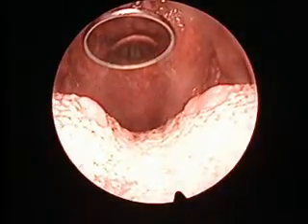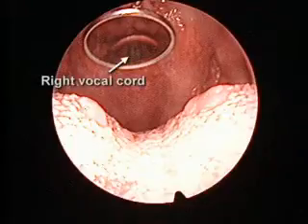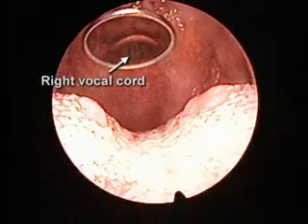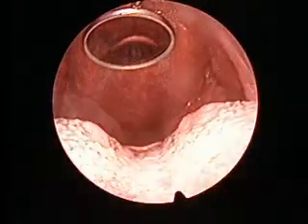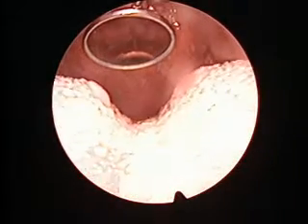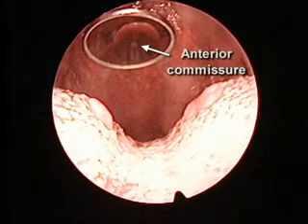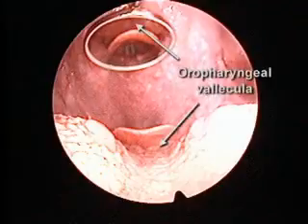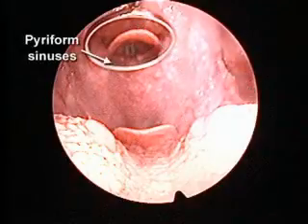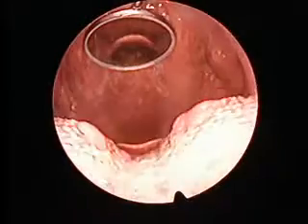E. With mirror laryngoscopy, the image is inverted. In other words, the right vocal cord appears on the left side of the examiner's view on the mirror, and vice versa. The anterior aspect of the larynx can be seen by asking the patients to say E in an even higher register. This fully visualizes the anterior commissure. The oropharyngeal vallecula and the piriform sinuses in the hypopharynx are also visualized and should be inspected for symmetry.